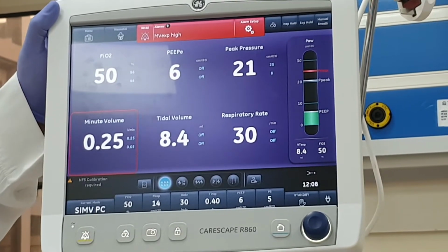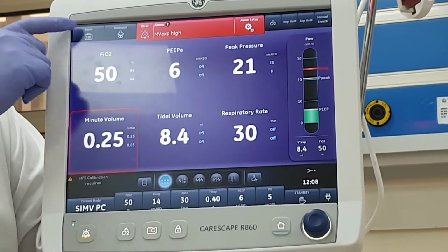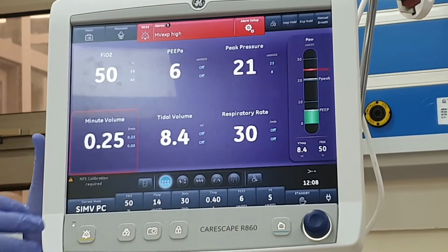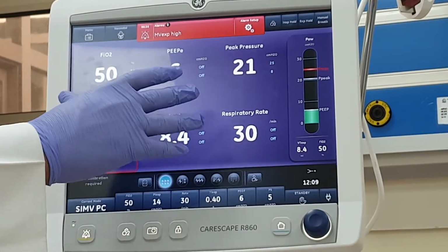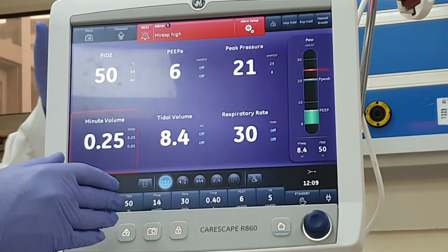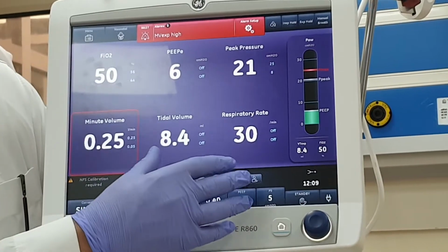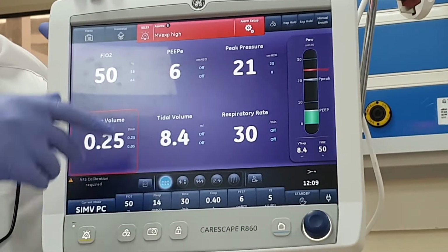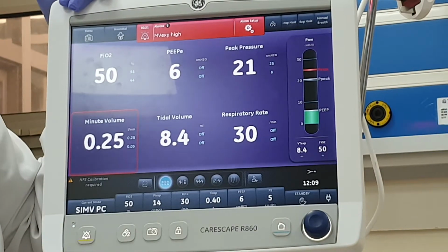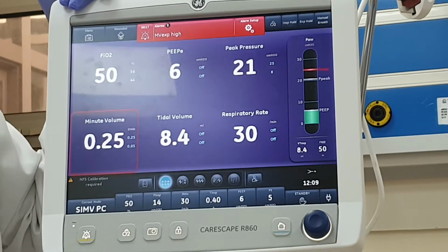So it's menu free. Yeah, there is a small menu over here, but it's not related to the navigation. If you want to navigate the system, basically you have the present, the future, and the past. The present means anything related to the patient right now: tidal volume, RR, pressure support, plateau, peak pressure, all of that. These are present.